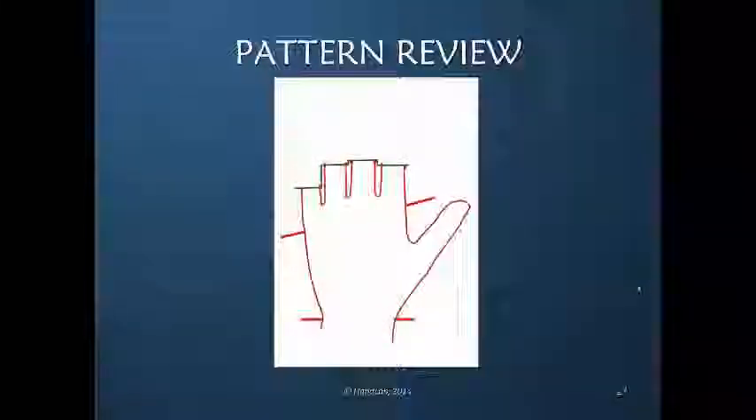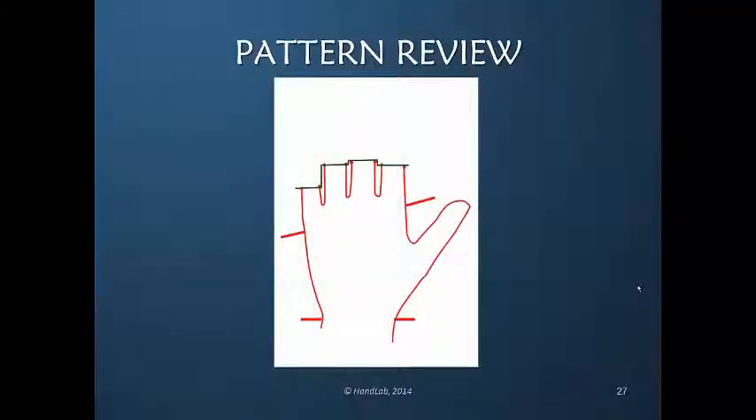Draw across each PIP joint axis and interconnect those with what I'm calling stair steps. And instead of doing a stair step, we do a gentle curve that approximates the length of each PIP joint.